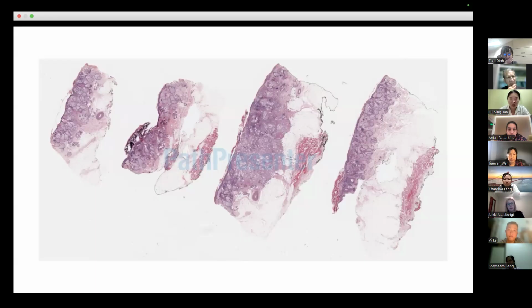But they usually should come from where we have fat. So this is coming from around the epidermis or the superficial layer of the dermis. Even though it's a very good thought, especially since in the high power picture it looked like lipoblasts, the location and the scenario don't look good for it. Sebaceous carcinoma is a very good thought because they have clear cytoplasm most of the time, and we're going to talk about it.